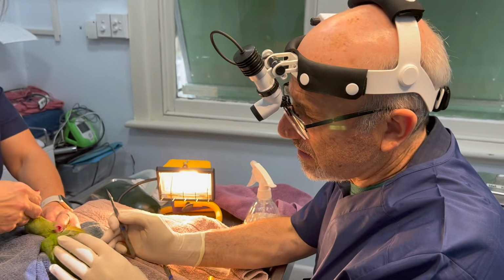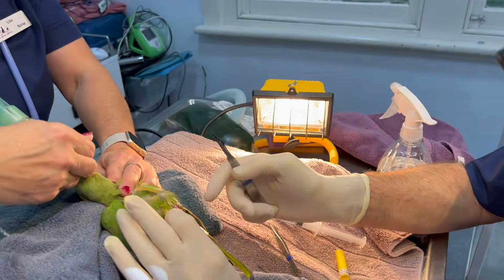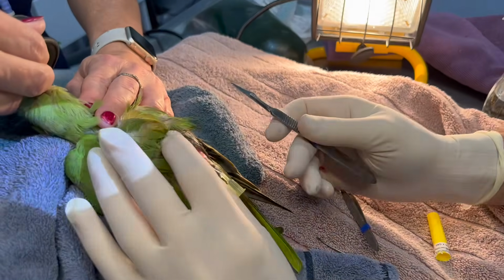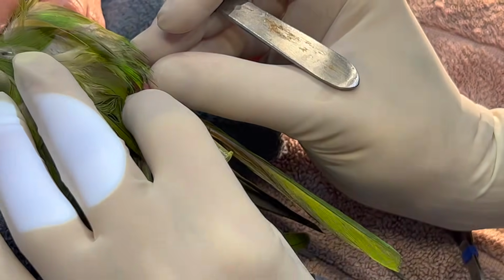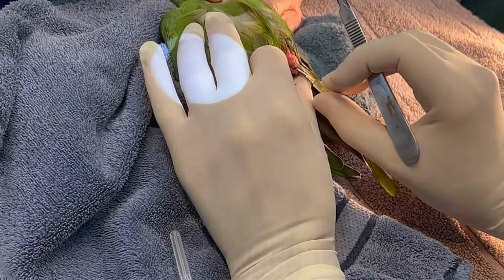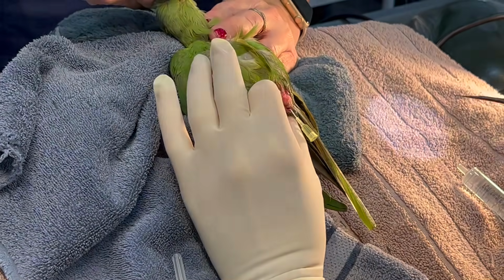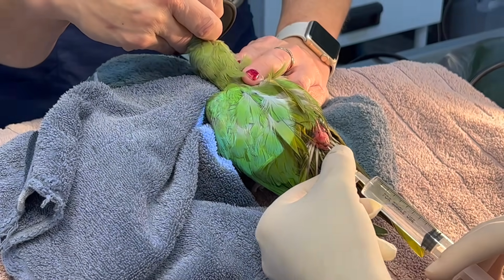Preen glands are glands that secrete oily secretions. Here we've got an infection or problem, or maybe just a disease of the Preen gland, and it's very swollen. And I've catheterized the Preen gland. I've put a small plastic catheter into it. I'll just put a little bit of fluid into the Preen gland.